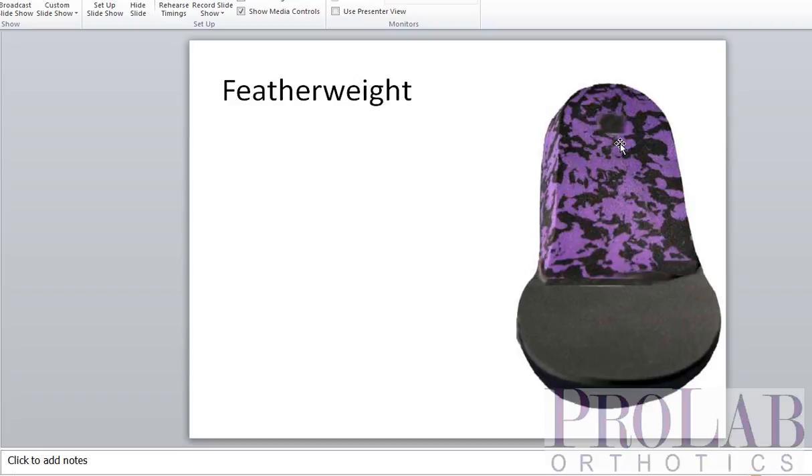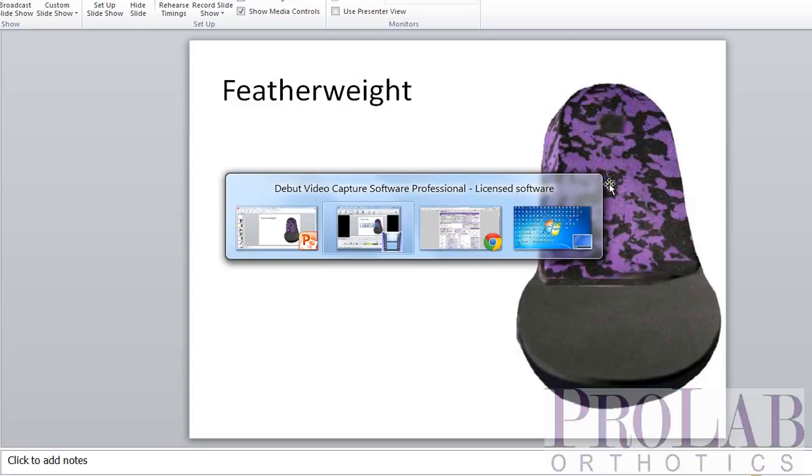A lot of people will use it for older patients where they want something a little bit more forgiving. The upside is it is softer and more forgiving. The downside is that the EVA can wear out over time and will probably not last quite as long as a full polypropylene device. You can get this EVA as either a medium density, which is fairly soft, or a firm density, which is actually very firm and would last a very long time. Truth of the matter is that if you're going to use a firm density, you might as well just use a thicker polypropylene — it will have the same amount of rigidity.